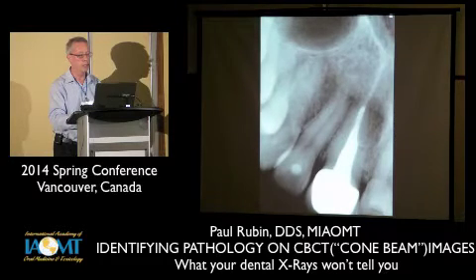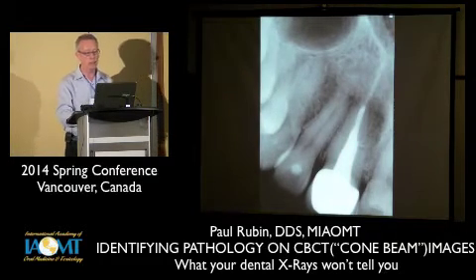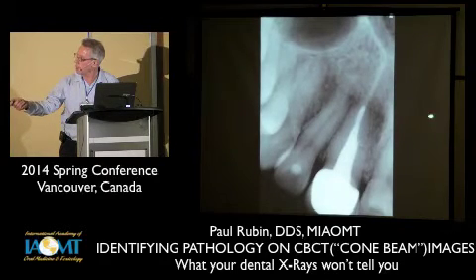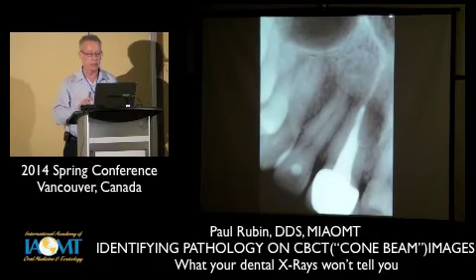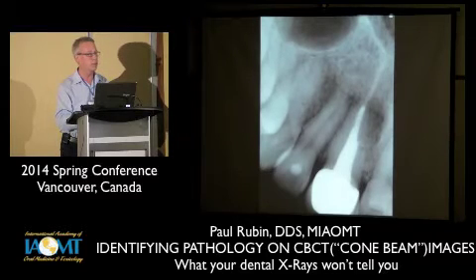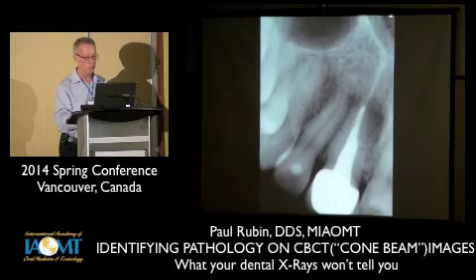What was this? Oh, yes. So this one, this central incisor, one dentist looked at this and said, wow, there's this big radiolucent area here next to this root canal. This is clearly a failing root canal, and this is so well defined it's probably a cyst, and was ready to go in and remove this tooth and the cyst.